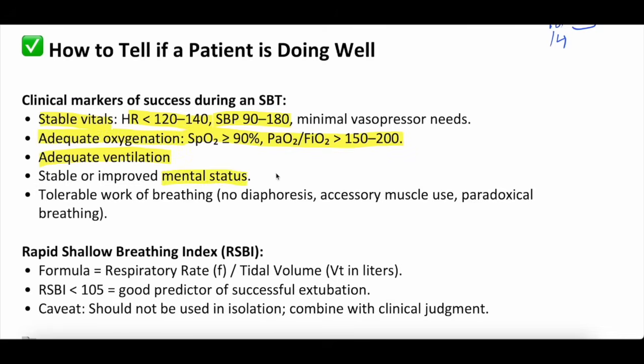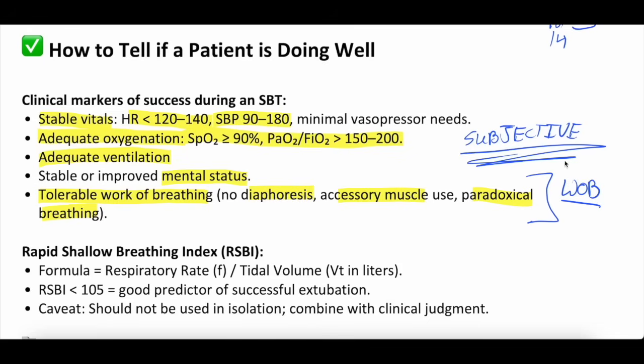And then is their mental status still stable? Did you put them on pressure support and now all of a sudden they're obtunded and unresponsive, maybe because they're hypercapnic? Their mental status has to remain stable. And then do they have a tolerable work of breathing? They're not diaphoretic, they're not using accessory muscles, they're not belly breathing, they're not super tachypneic, right? Do they have a tolerable and stable work of breathing is the other critical thing. And this is all very subjective to a degree. You're looking at the patient, you're like, what do they look like? How are they breathing? Do they look comfortable, et cetera, et cetera.